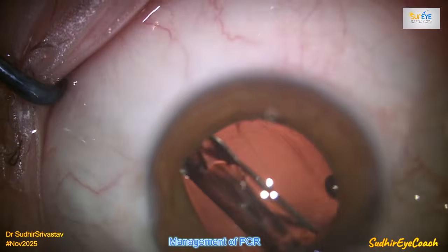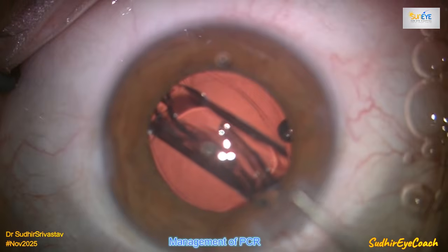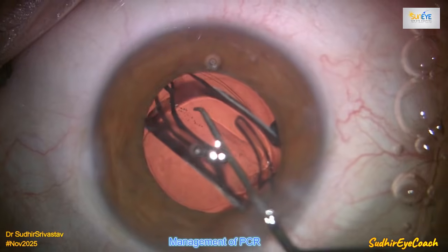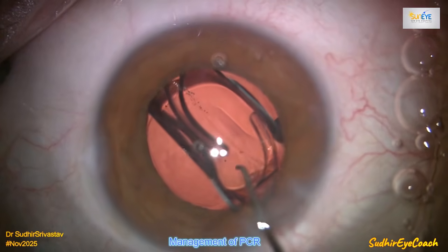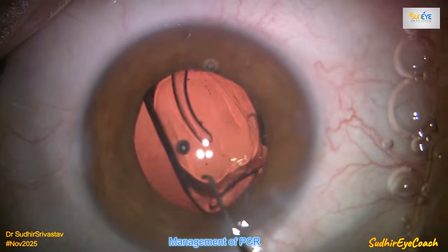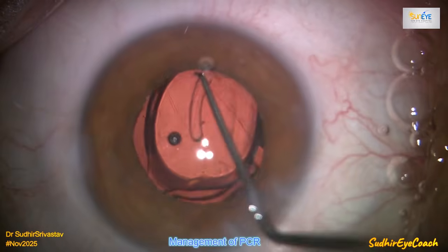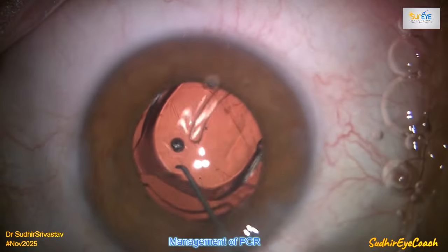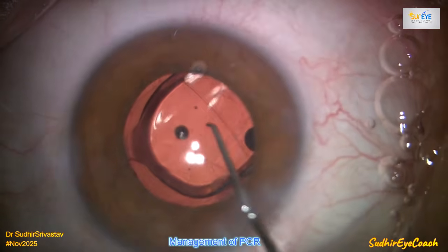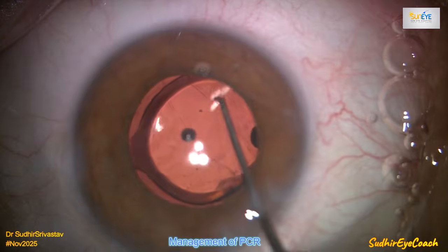Because I was able to locate the bag even in the two parts, I decided to go with in-the-bag implantation. If you are not sure about implanting the lens in the bag, then you should go with multi-piece lenses, because a single piece lens is quite thick, and in the long run it can give chronic uveitis and glaucoma.